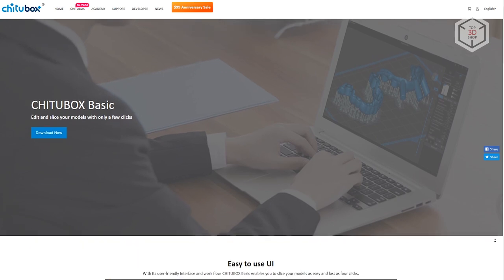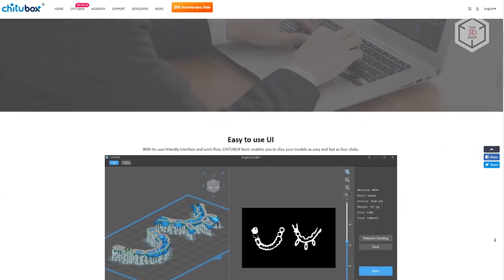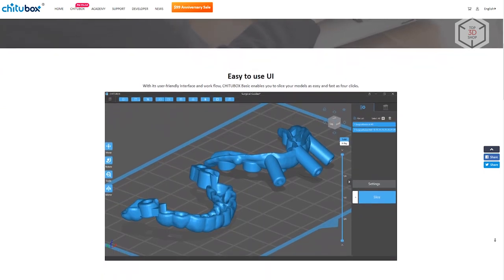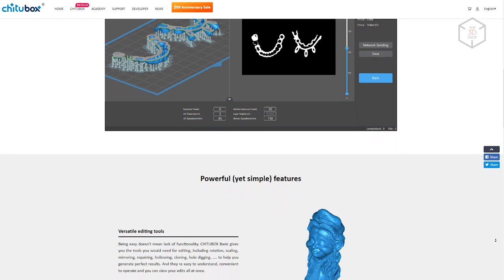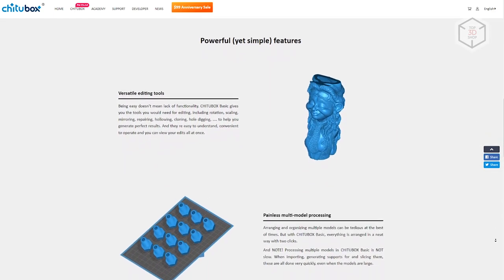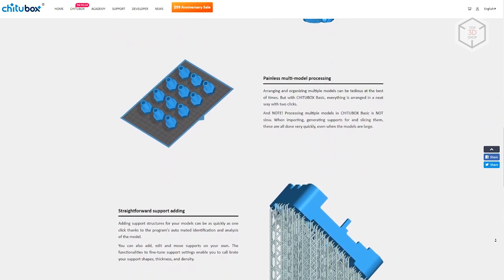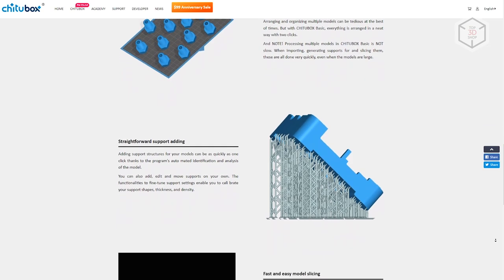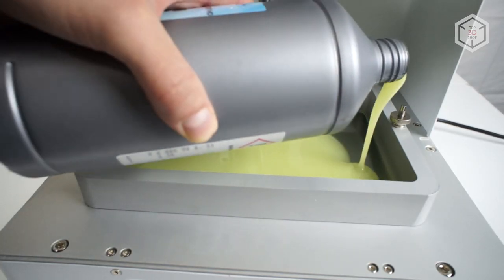In addition to the specialized software, the printer is compatible with one of the most popular slicing programs, ChituBox, which is free and carries all the necessary functions. The interface is also quite simple, and since the slicer is extremely widespread, it's easy to find plenty of tutorials and troubleshooting guides for it. Of the proposed options, ChituBox seems to be the most convenient and familiar, so we'll be using this software for testing. For the first test, we used NextDent Model Ortho Dental Resin.